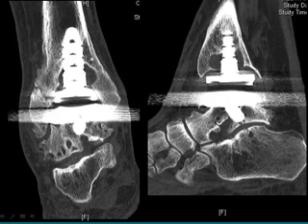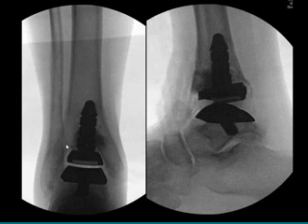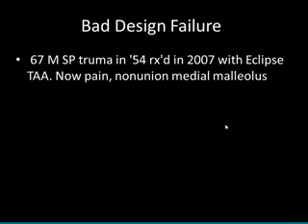Now, here's the cyst at the distal part of the stem, and you can see it wraps all the way around the stem. These cystic changes were there before surgery. I did not fuse his subtalar joint because he had good preservation of the posterior facet. And I elected to treat him with a calcium phosphate injection. So I took him to surgery, took off a window over the anterior tibia, filled this area with calcium phosphate in a liquid form so that we go around the prosthesis, and similarly dealt with his talar component.